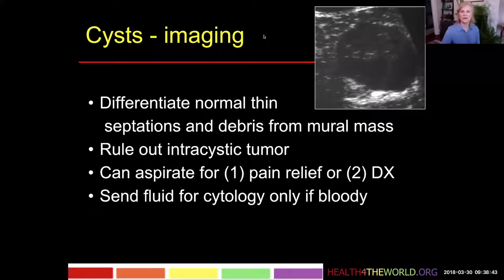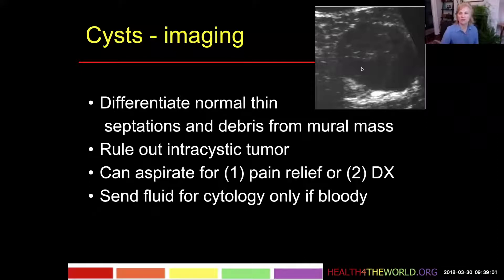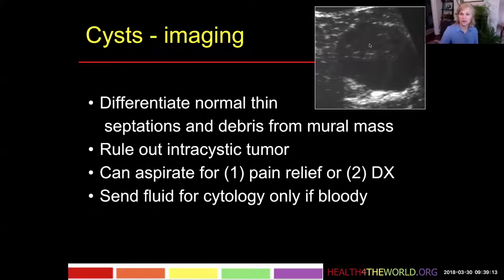Here's an example of a patient who had pain in the breast. We see this structure which has a lot of cystic elements, but it also has a thin septation, and more importantly, this thick anti-dependent material. This is a complex cystic and solid mass — not a simple cyst. This is an intracystic papillary carcinoma that we need to diagnose and treat. These are the findings we're wanting to rule out when doing ultrasound of women we think may just have cysts.